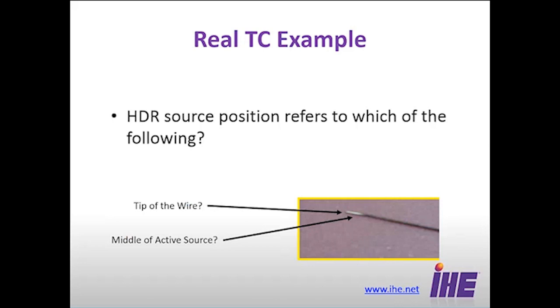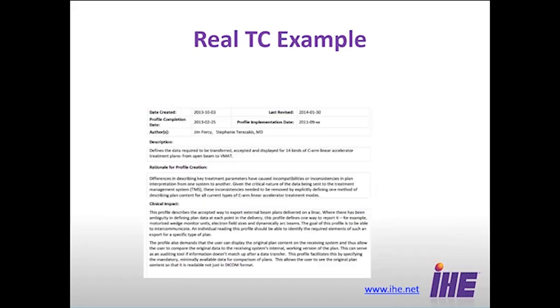This is one of the things that IHE-RO works out: what's the agreement for the definition of the position of the source. It sounds trivial, but it actually is kind of important for accurate dose calculations.